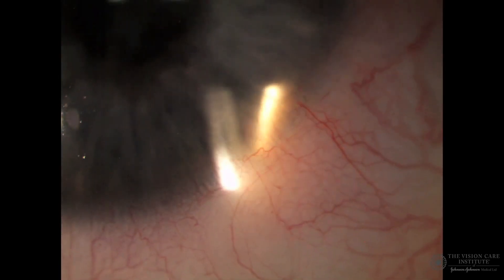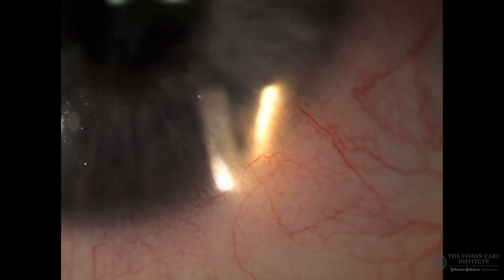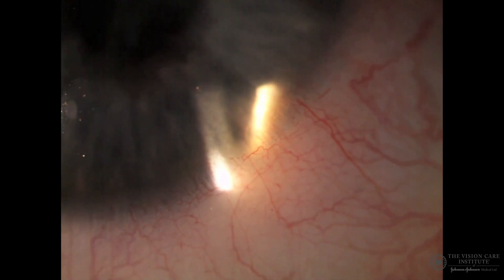Further magnification and increase in brightness will make the structures even more visible. When this is done, we can see the blood vessels in detail and how these limbal blood vessels are looping backwards rather than heading to the centre of the cornea. This is a very useful technique to detect neovascular growth.